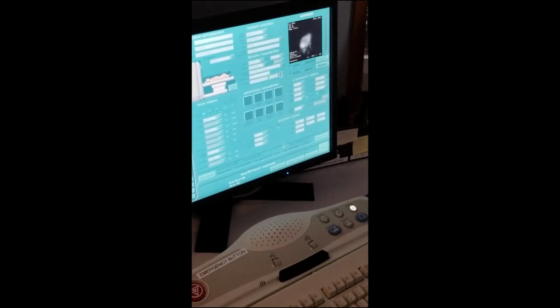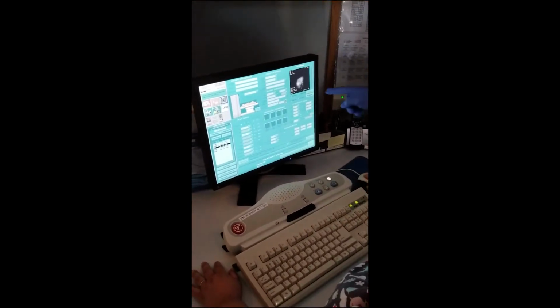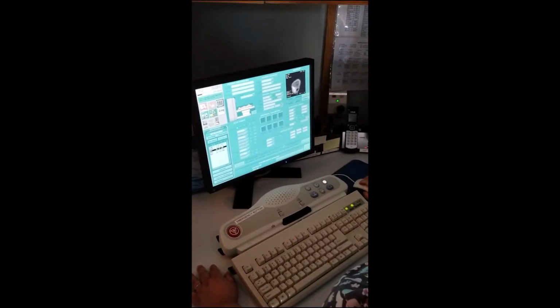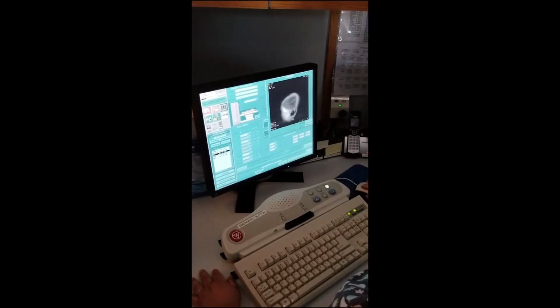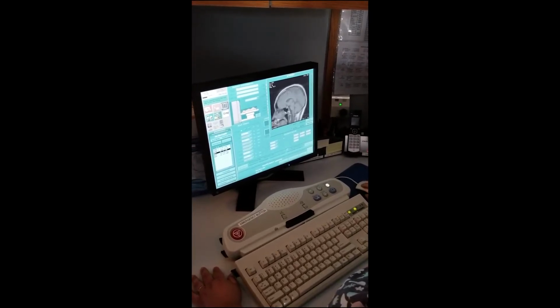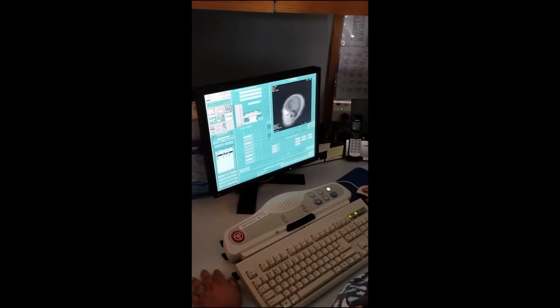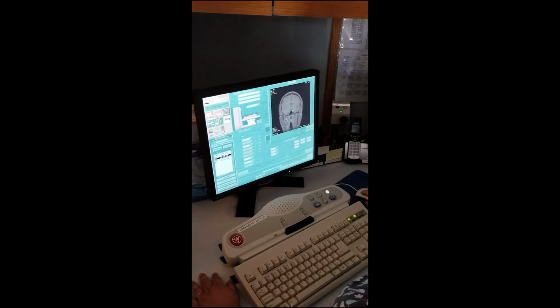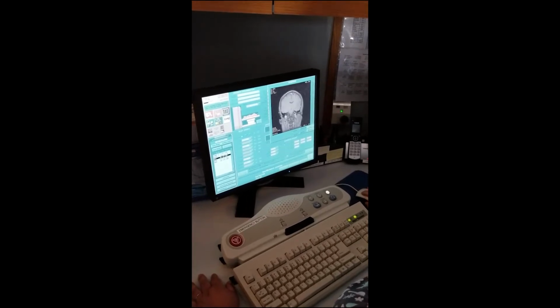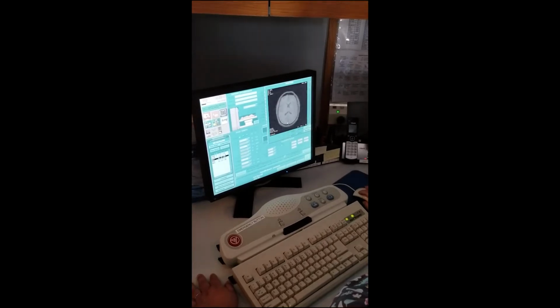Of course, in between, we want to check and make sure what we did was good. Just maximize it or look at it like that. Isn't that pretty? It's gorgeous. You see the ears? Oh, wow, that's beautiful. And we didn't even do good image quality. This is digital, but it's not 4K. It's not even HD. I'll tell you why later.